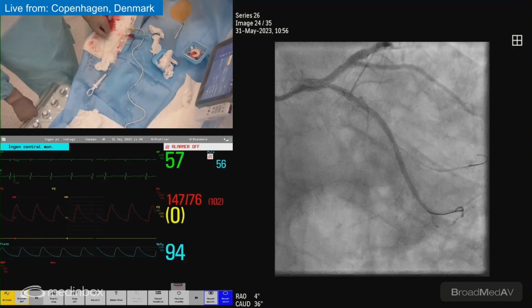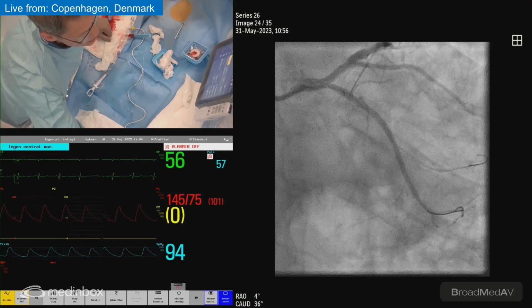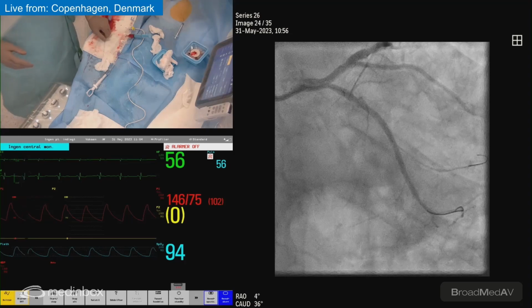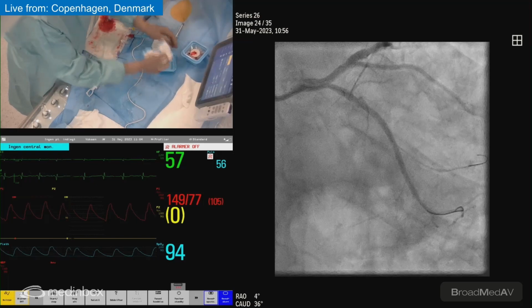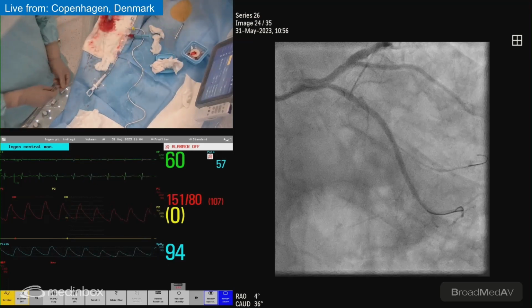So you just want to prolong. Can you show with the arrow on the screen where you want to stent up the proximal stent? Yeah, another IVUS, just to make sure. So now we do some POT, and then we go down with the IVUS to see exactly the length of the proximal stent.